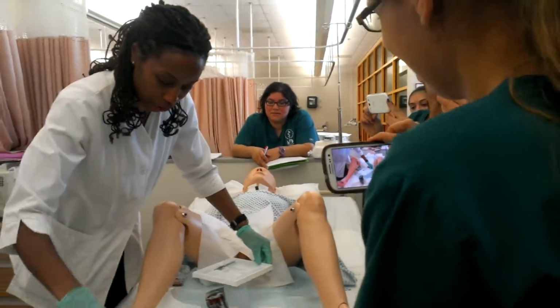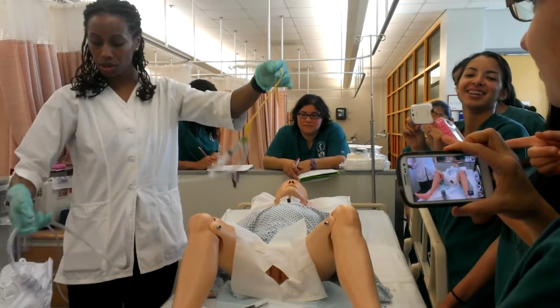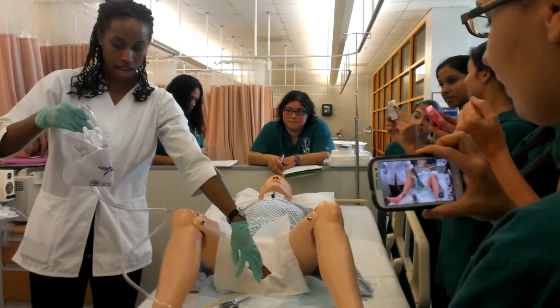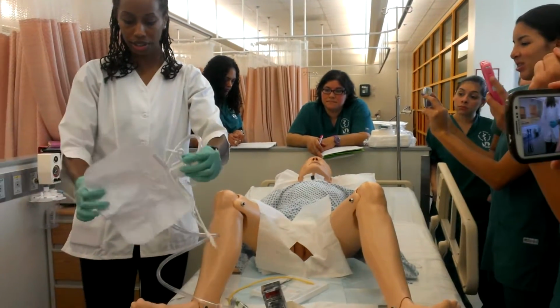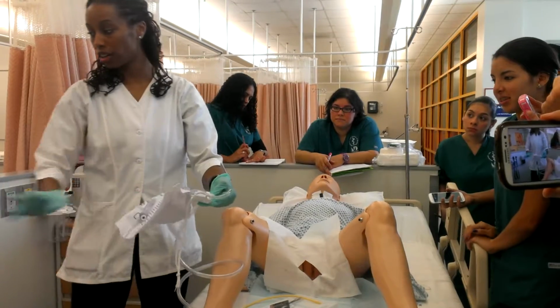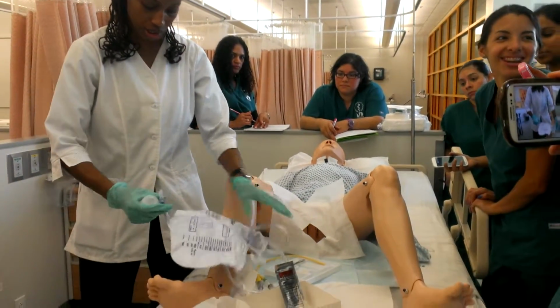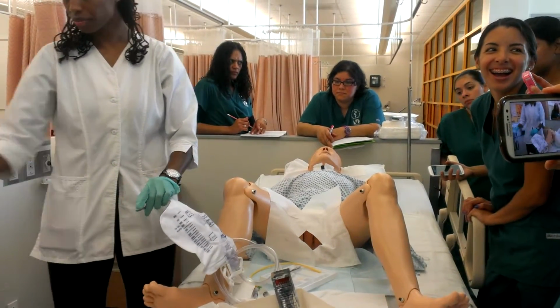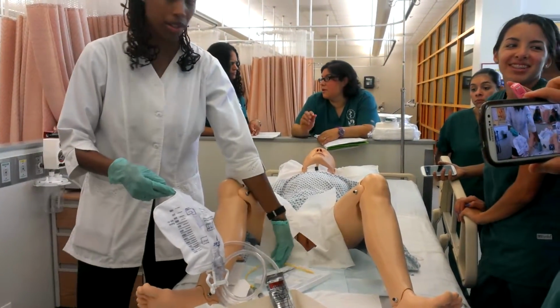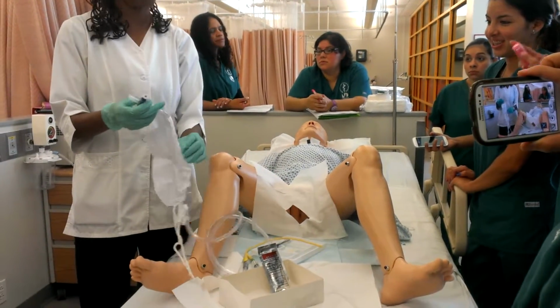All right, now the difference in men. If you want to do a specimen collection after you've anchored your Foley catheter, the very first urine that drops into the bag is considered sterile, and all you have to do is just pull this out, and then you can just squeeze into here. But it has to be right when you anchor this. If you go back 15 minutes later, you can't. Nope, it's not sterile anymore.